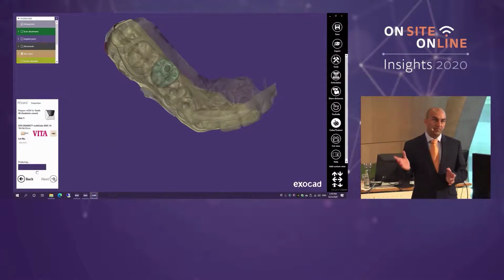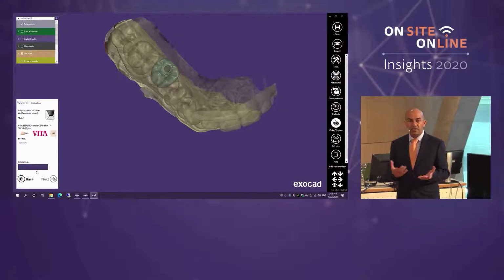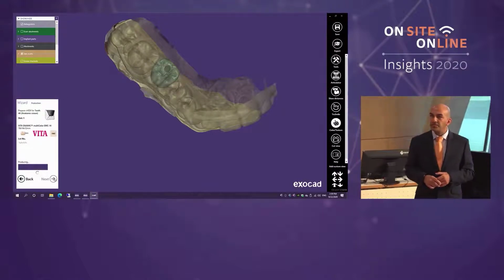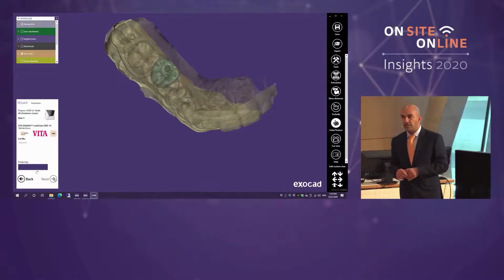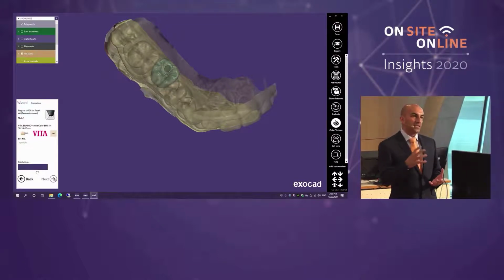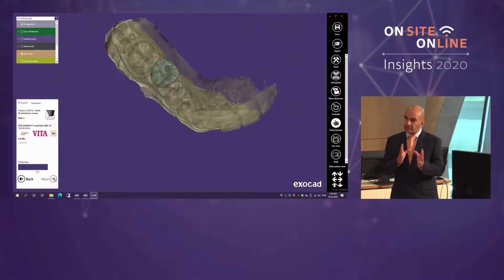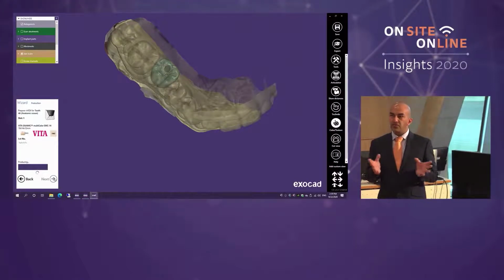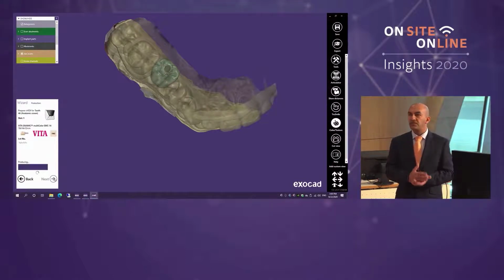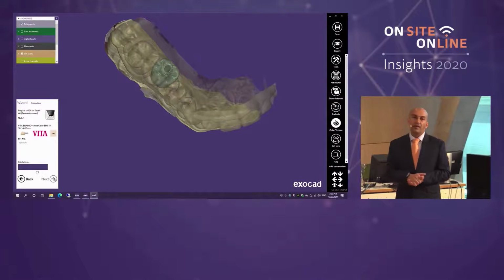And it just so happened that the year after I graduated, CEREC 3D came out, I saw it, I had an opportunity, a bank gave me a loan and I bought it. And I didn't even have the keys to my practice. That's what I did. That was my USP. So when I set up my practice, it was going to be digital. It was going to be that unique selling point from day one. So I've been doing this since I bought my CEREC machine in 2003. So yeah, 17 years.